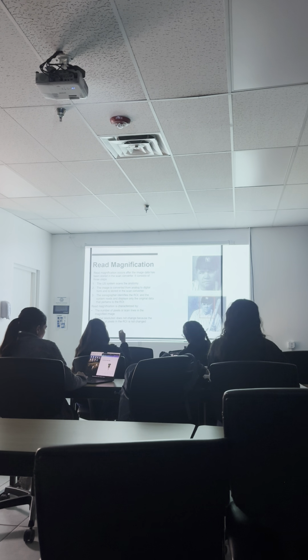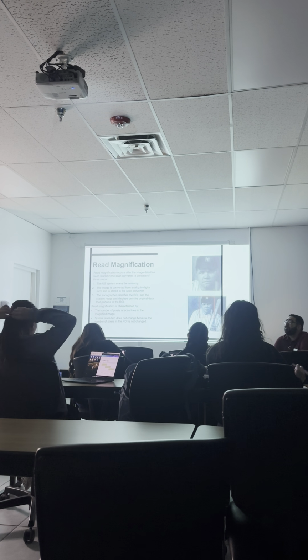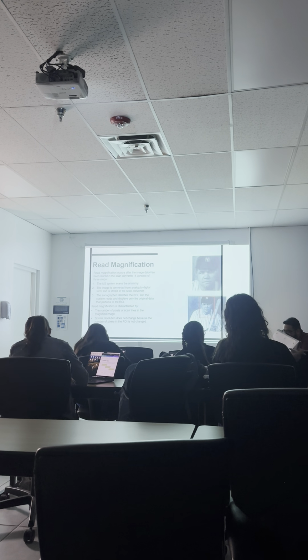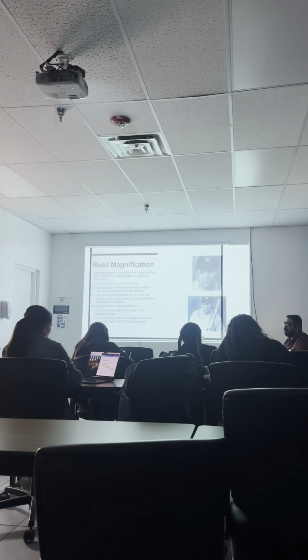Okay, so read magnification. What do we say that read magnification was? It's a number before freeze. After freeze. Okay, so just imagine that you're writing down notes. That's live, right? So what do you do when you're done writing your notes? You pick it up and you read it. What we're doing live is we're writing. When we press that freeze button, then we read. So read magnification is magnification after it's frozen.